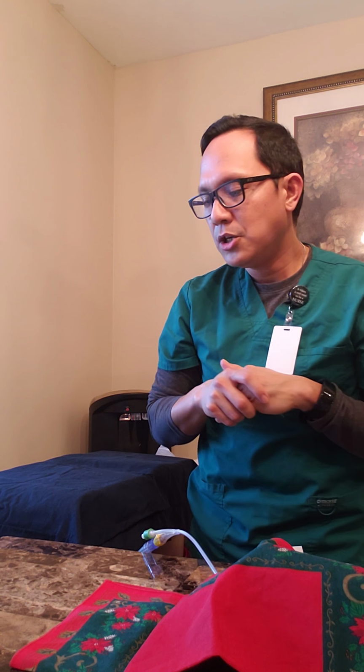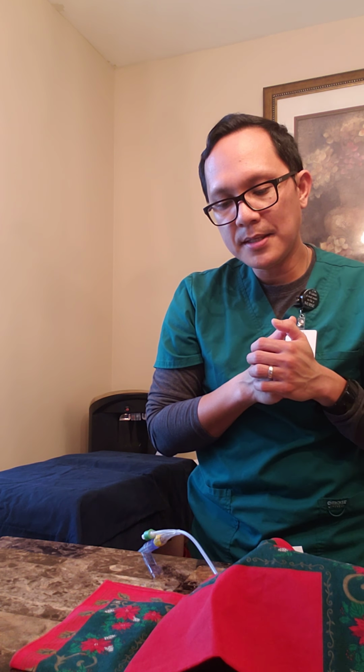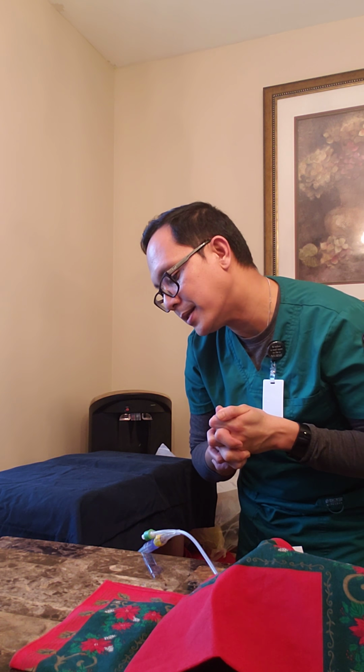At this point in time, I want to make sure that my patient is in a comfortable position, the bed all the way low. She has the call button if she needs anything, any personal equipment, personal stuff that she wants by her. And if I have to bring the side rails up, I'm going to do it as per facility policy and procedures. Do you need anything, Mrs. Smith, right now? Before I leave, I want to make sure I check on the urine that's coming out of the Foley, checking for quality and quantity.